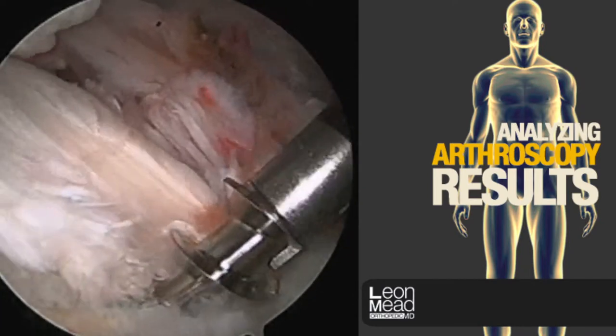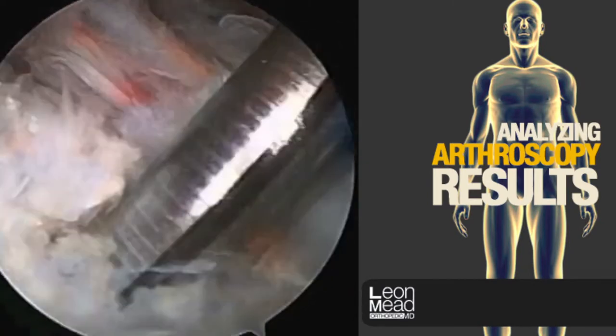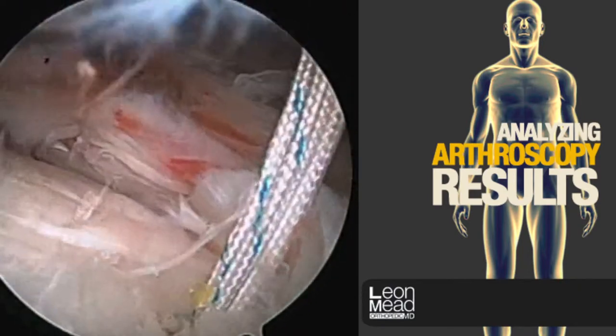We're now inserting an anchor. It has a corkscrew that is buried in the bone and has sutures passing through it.